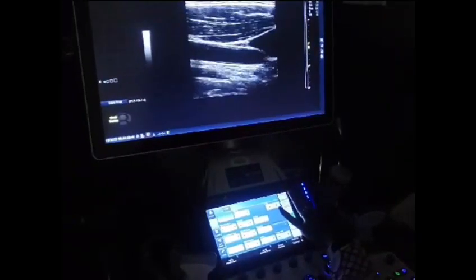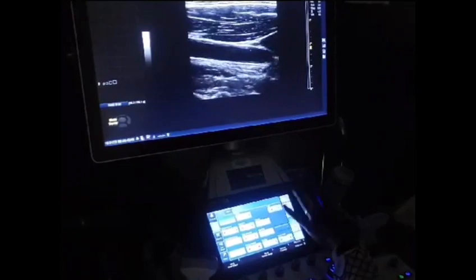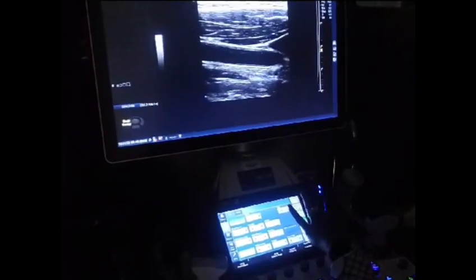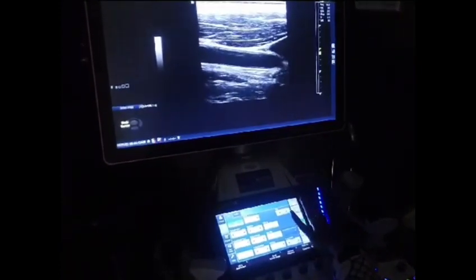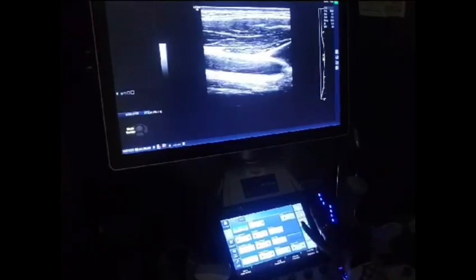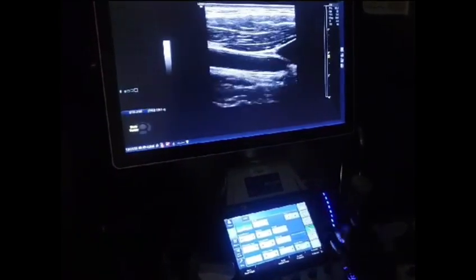Right, so today I'm just going to touch base on knobology. Right now I'm looking at the common carotid artery. A few things you want to know when you're imaging, doing color Doppler, spectral Doppler, whatever you're doing: TGCs. What is your TGC? Your TGC is quite depth specific. You're changing the gain at different depths, so I can do different things with my gains at particular depths, okay? But I'm going to just go ahead and center that TGC at this point.